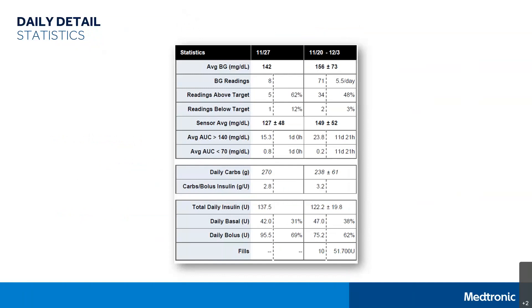In the Daily Detail, the next thing you can look at is the statistics section. Here you will see an average blood glucose, an average sensor glucose, as well as daily carbohydrates and the total dose of insulin. The report puts the stats for the one day you've selected on the left side of the column compared to the average over certain periods, allowing you to analyze the impact a certain activity or event may have on your glucose levels. When looking at total daily insulin, many people aim for 50% basal and 50% bolus, though that may not be the case for everyone — you can have a conversation with your healthcare provider about that. You can also use total daily insulin to help estimate how much insulin you'll need from the pharmacy.